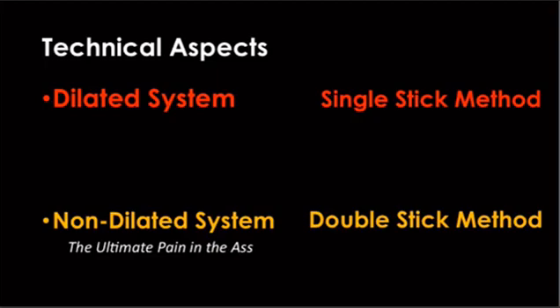So when opacified, the posterior calyxes are typically seen end on, and the anterior calyxes will project more laterally, then AP projection. However, if you're injecting a small amount of air, CO2, you expect that the more posterior calyxes are going to fill, because the bubble is going to rise in a prone patient.